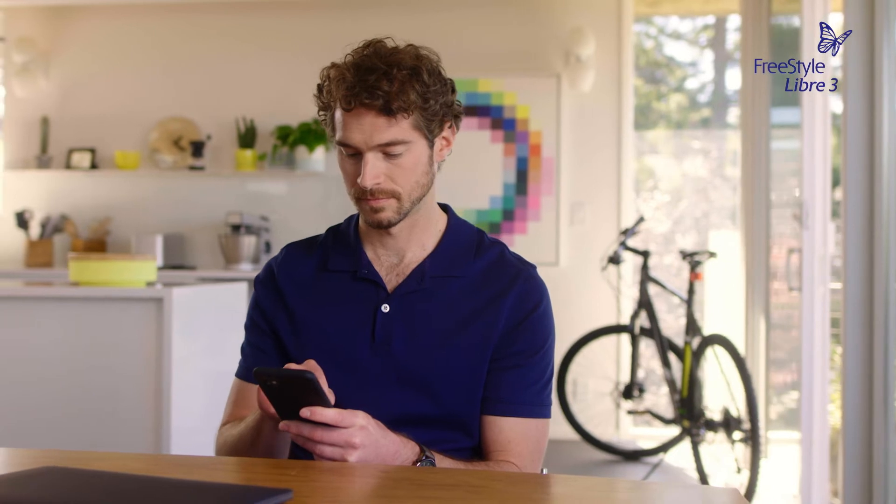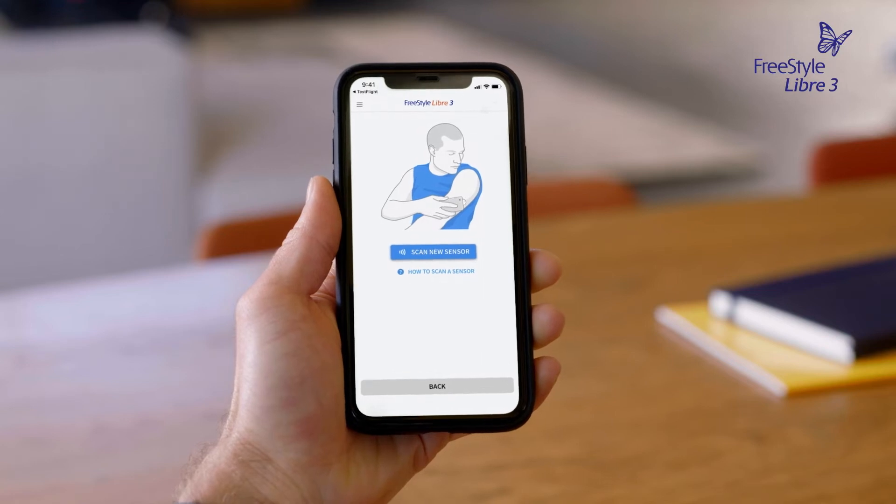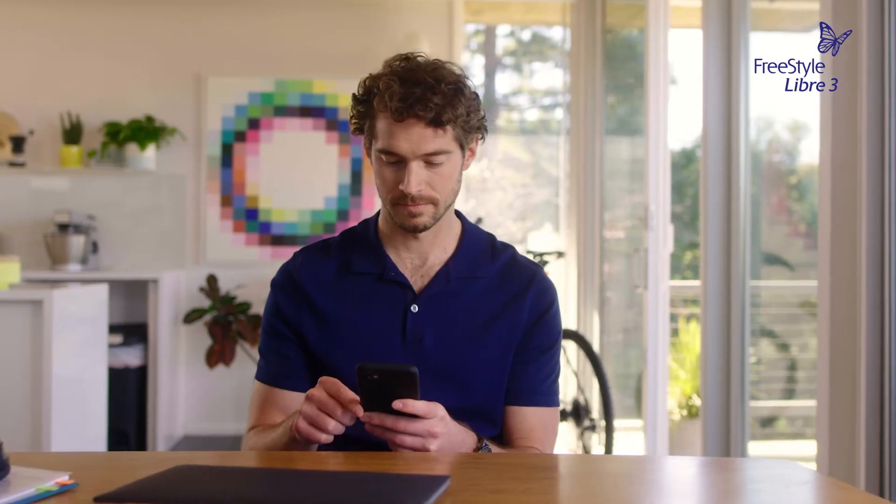Continue following the on-screen messages to finish setting up the app. Setup is complete when you see an illustration to scan a new sensor. Then you'll be ready to start your sensor.